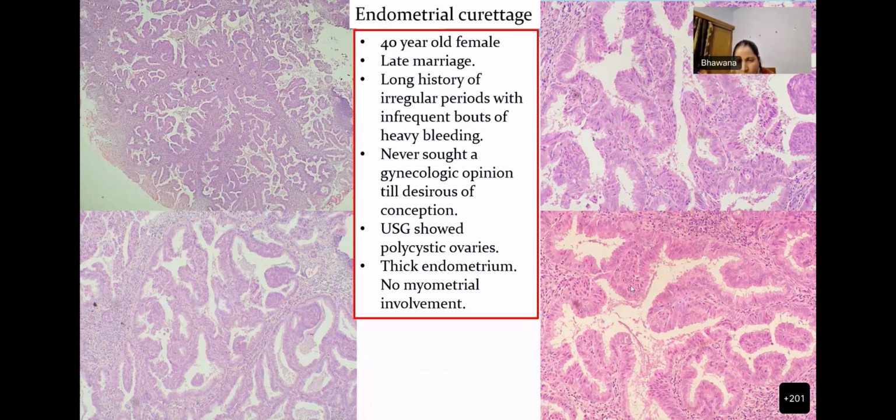But these glands are not round like you saw in the others, nor are they branched in the usual way. More of a columnar kind. Exactly. Yes. I can see some cytoplasmic mucin. Some cilia I can see over the cytoplasm. Snouts, no? I think I can't see apical snouts. Okay. All right. So what would you have called this?